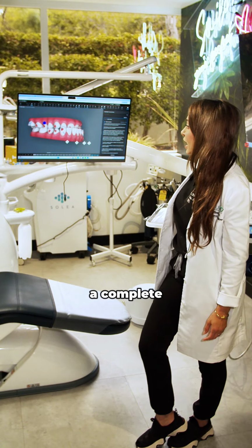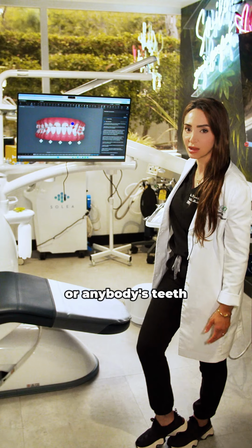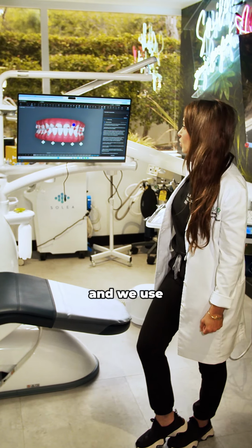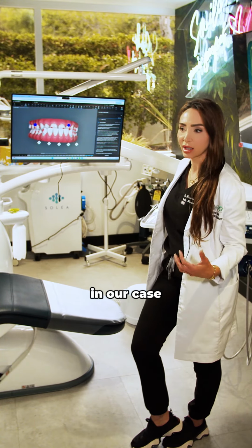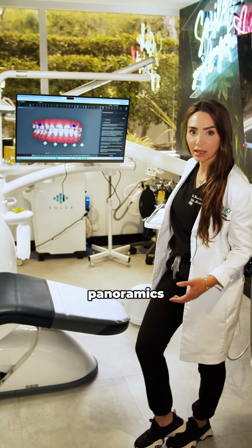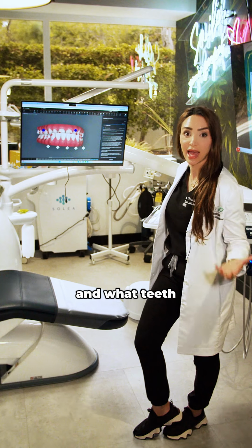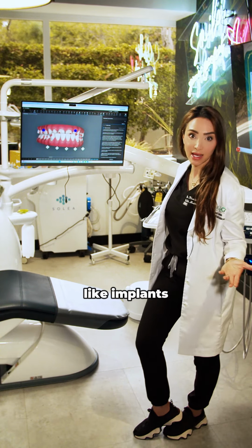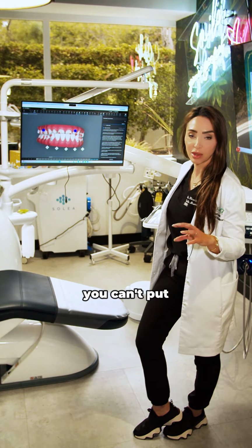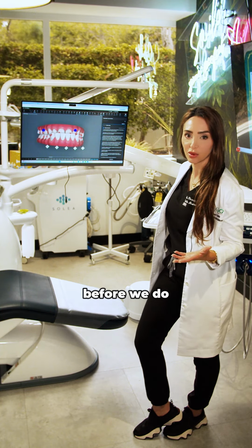We do a complete digitalized version of her teeth, or anybody's teeth, when they're doing Invisalign. And we use their x-rays. In our case, we use cone beam CTs and also panoramics, getting a full idea of what kind of dentistry they have in their mouth and what teeth can and can't move. Like implants can't move. Crowns, you can't put attachments on them. So these are some things we have to understand before we do the Invisalign.